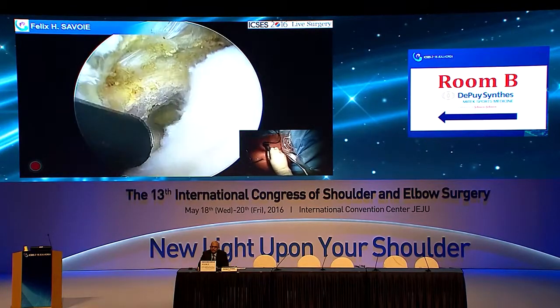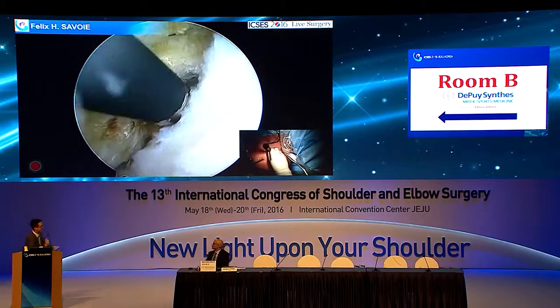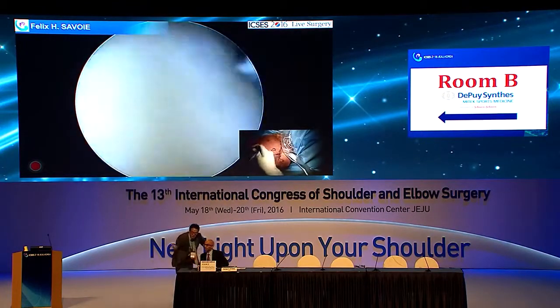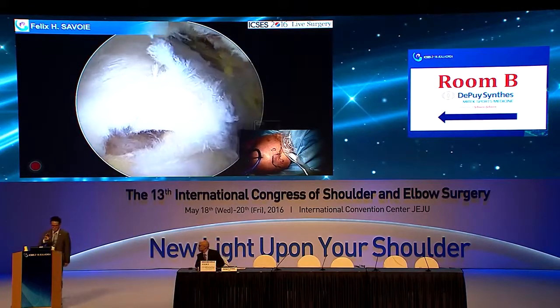So with the accessory pec minor tendon, you can see where we took out that little hook on the coracoid where that impact lesion inside the shoulder came from. So then we've done everything we need to do. So time to fix. We're going to back up and look at our cuff. We'll get our spinal needle.